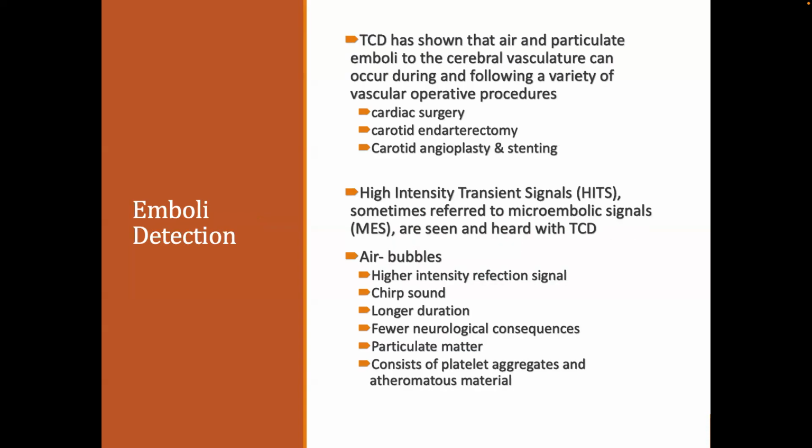Okay, so transcranial Doppler is also used for emboli detection. Surgical procedures like cardiac surgery, carotid endarterectomy, angioplasty, and stenting can introduce air emboli and particulate matter, especially like a carotid endarterectomy where they're scraping away that plaque. Some of it can travel.